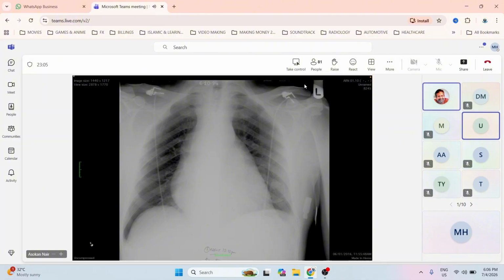Okay, fine. So diagnosis part, you're okay, you did all right. So this is a typical appearance of a pericardial effusion. After you say that is a pericardial effusion, your next sentence would be that you would like to do an echocardiogram to confirm the diagnosis.